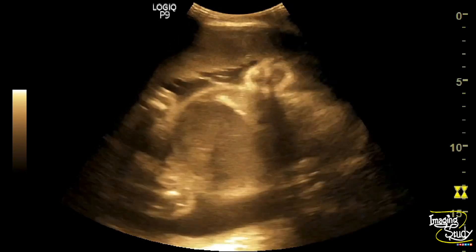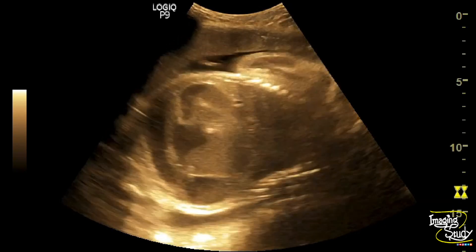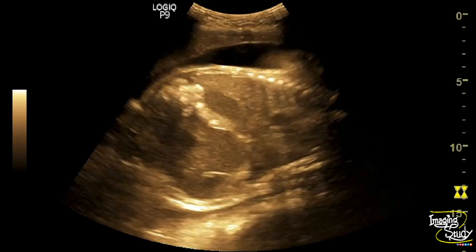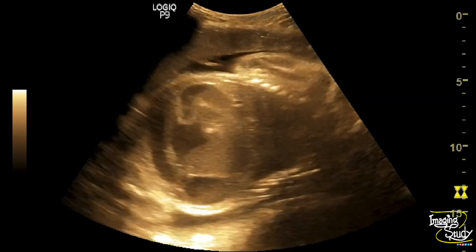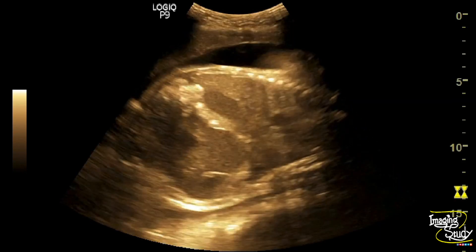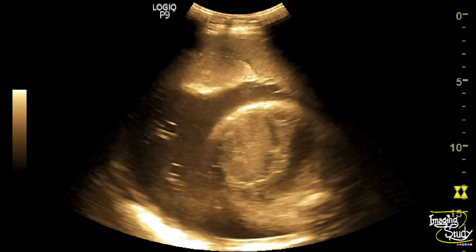This intestinal loop doesn't look quite like a coffee bean shape, so we can't say volvulus confidently, but after delivery it should be confirmed.